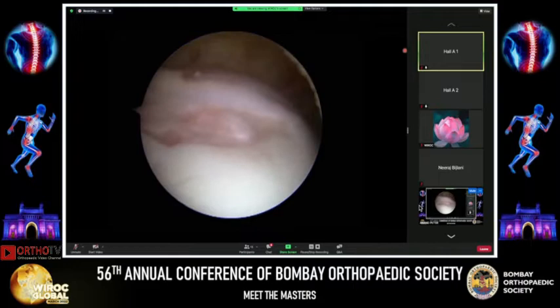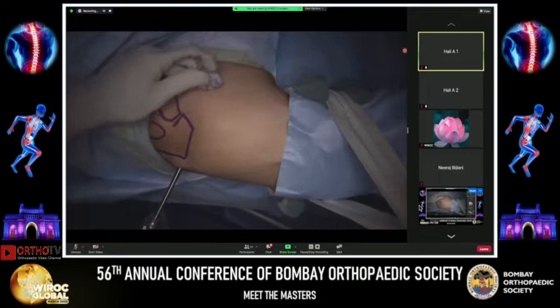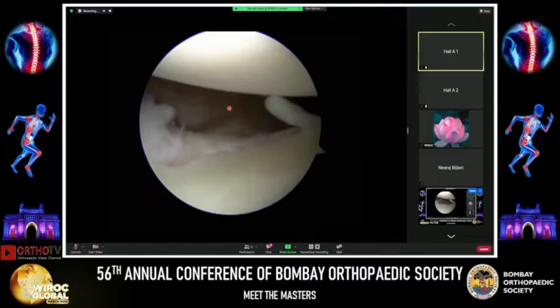We can note at the posterior aspect a small Hill-Sachs indentation — a very shallow one — which is typical of patients with hyperlaxity. I then take my anterior portal in the rotator interval, typically at the midpoint between the coracoid and the anterolateral angle of the acromion.